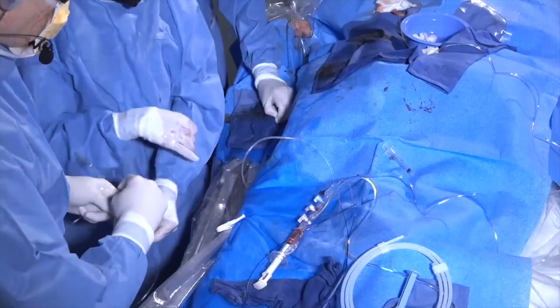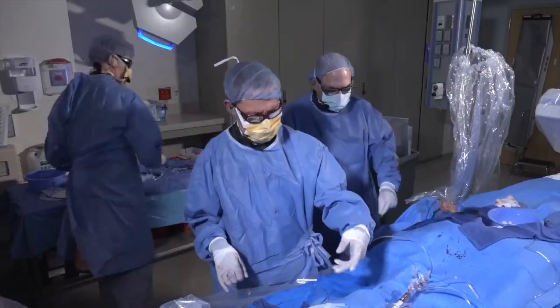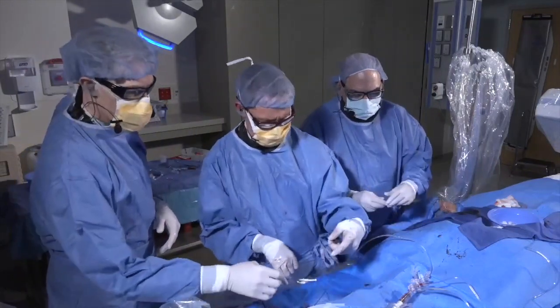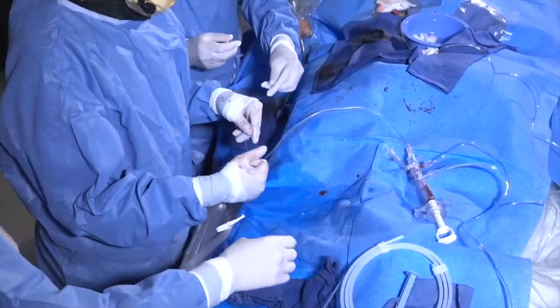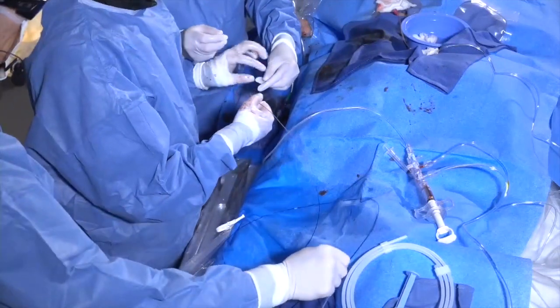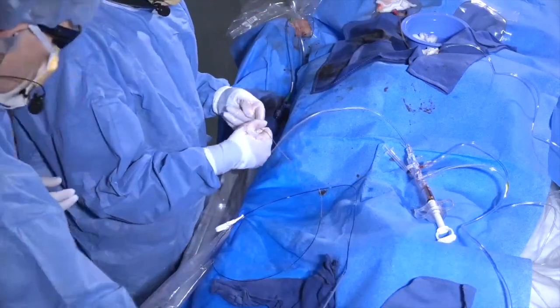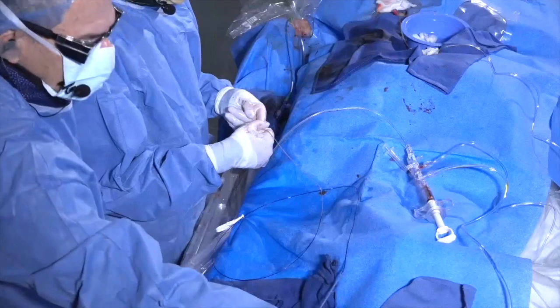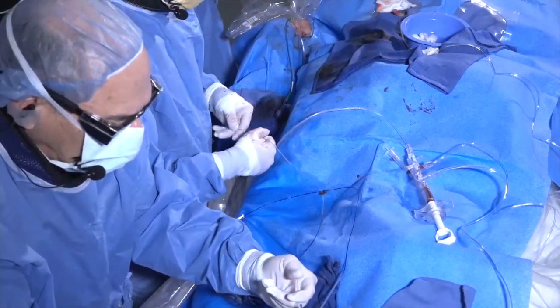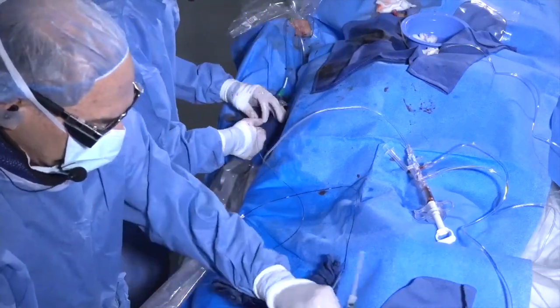I think we're going to have to post-dilate more. That was a 3.0 balloon at high pressures, 20 and 24, but I think it's too small. Just be careful with that. That back end is all bent up already. All right, so we just bought a little bit more time. We do have a hard out at 20 after, so I think that'll give us enough time to see this IVUS run and go from there. We do understand you have to post-dilate the proximal vessel as well. Go ahead, Glenn. Do you want to put it there?